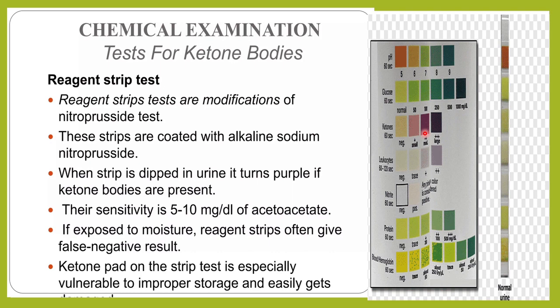This is a very sensitive test. Even around 5 to 10 milligram of acetoacetate, of ketone, will be detected. But one thing you have to remember in this test: if you don't store the reagent strips properly, if you have not covered the lid, or if you have left them exposed outside, it will give a wrong result.